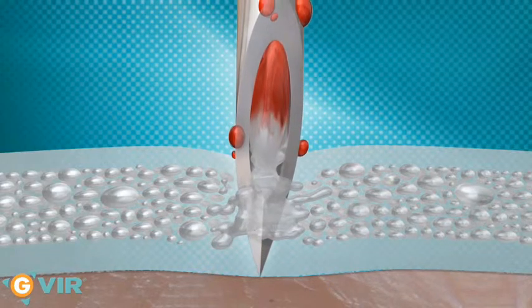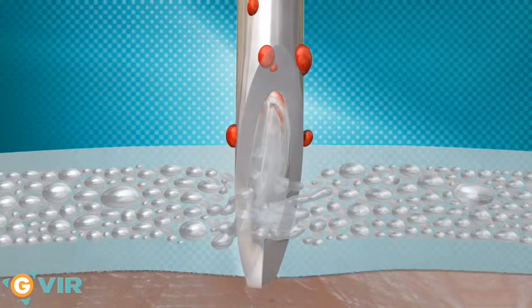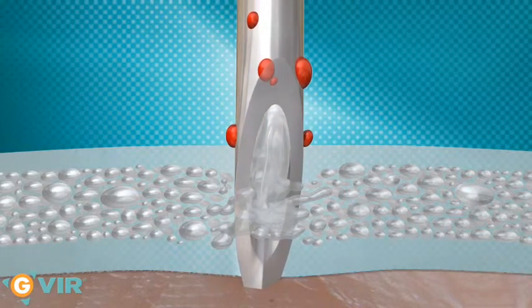The needle finally pierces the outer layer. The disinfecting liquid is expelled due to the release of pressure and the elasticity of the material.